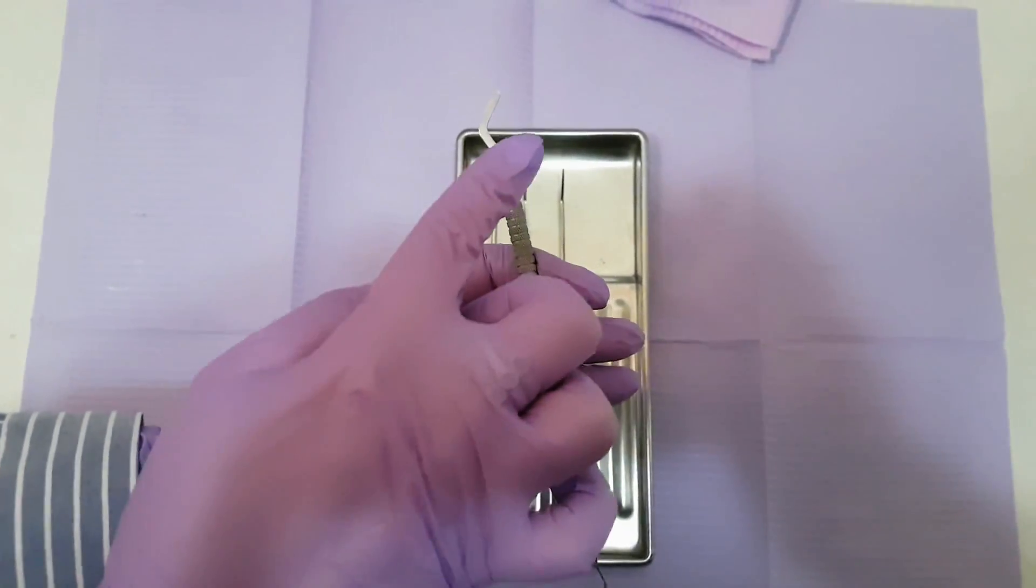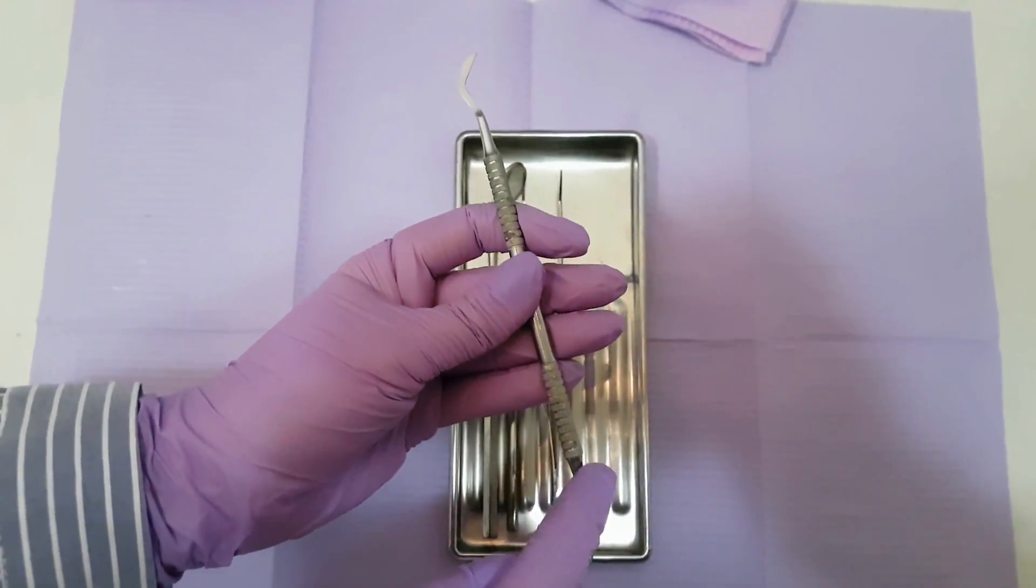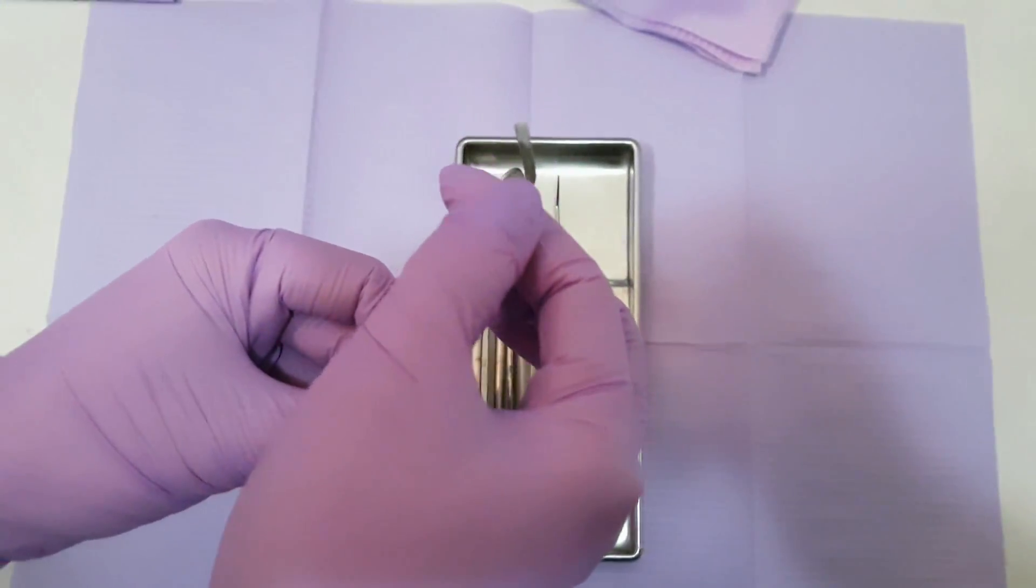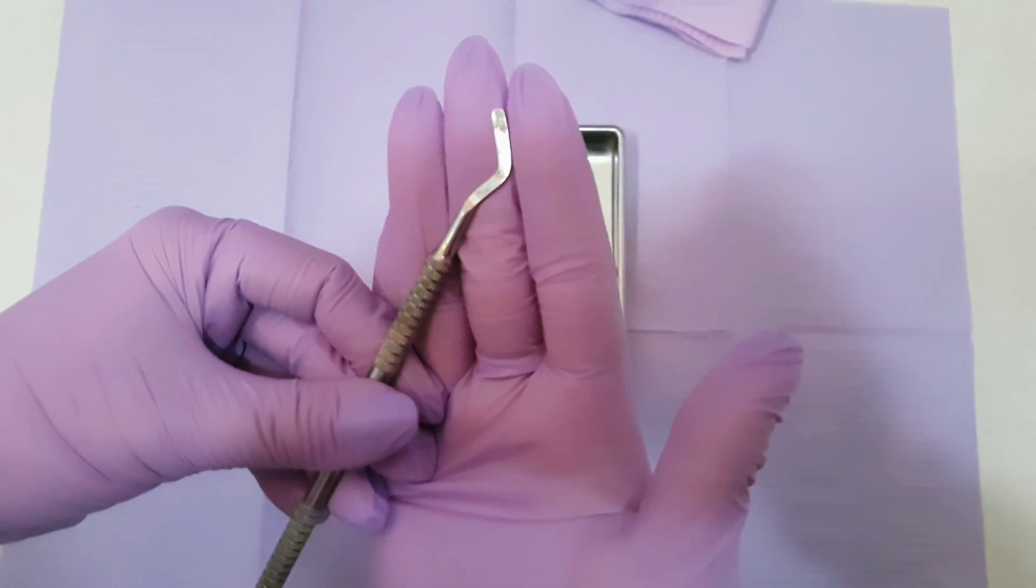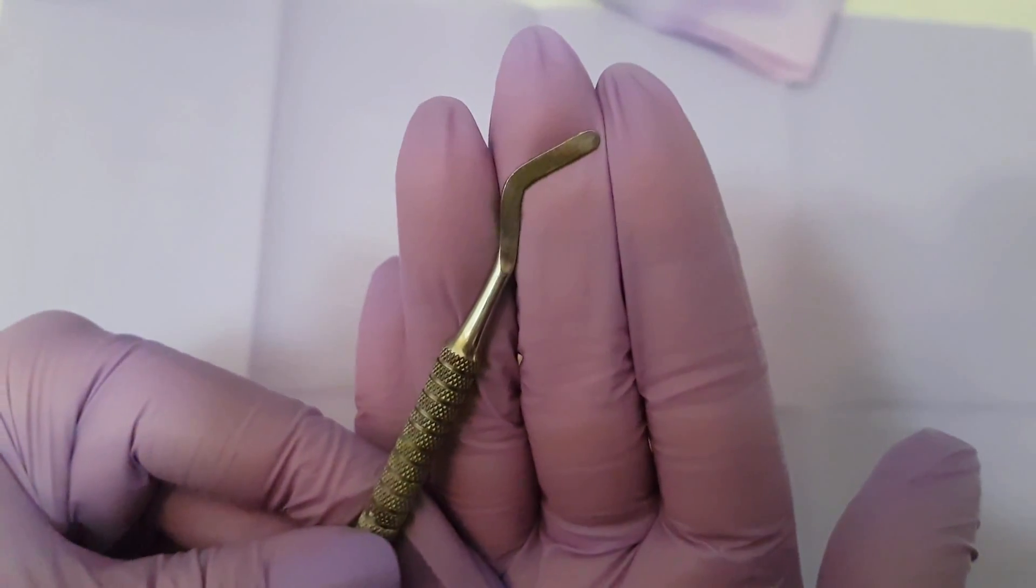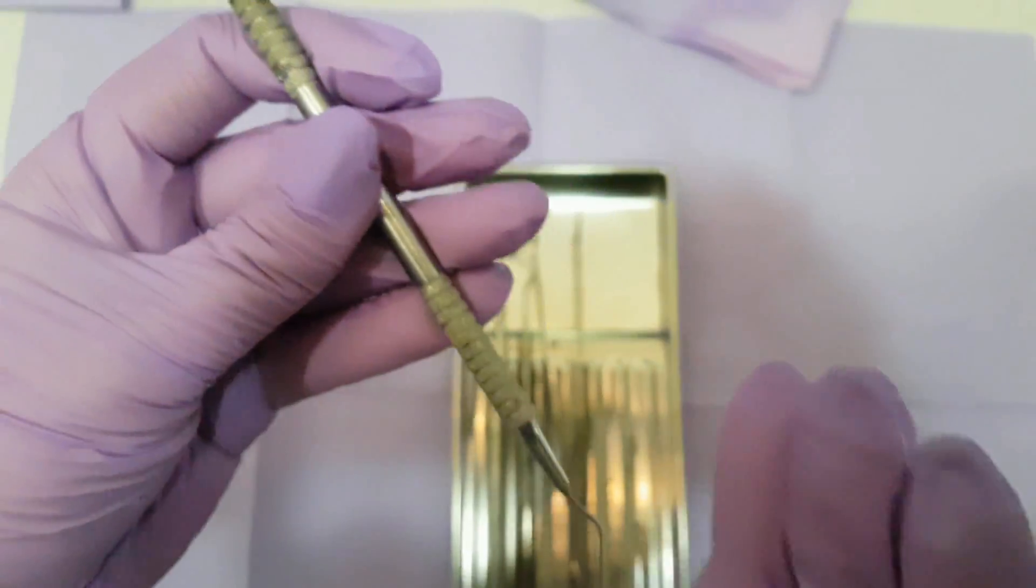And last we have the plastic instrument. This instrument has two working ends and is mainly used to work with dental fillings for the tooth when we treat cavities.